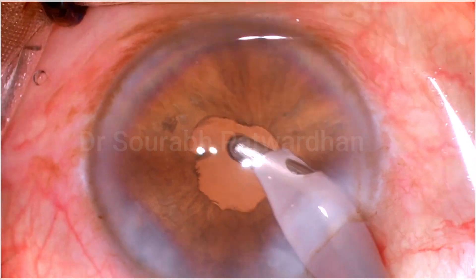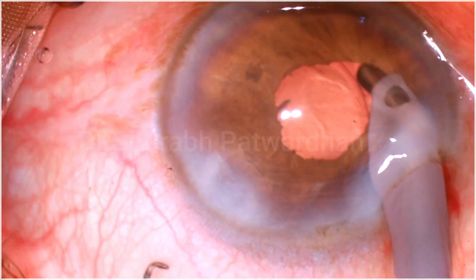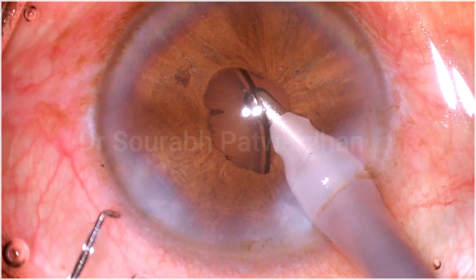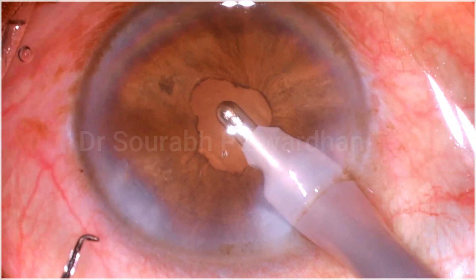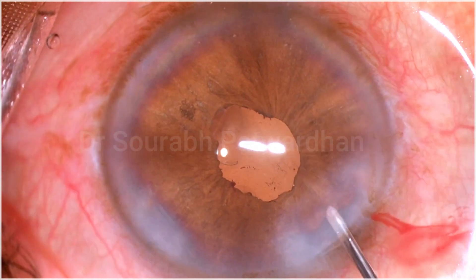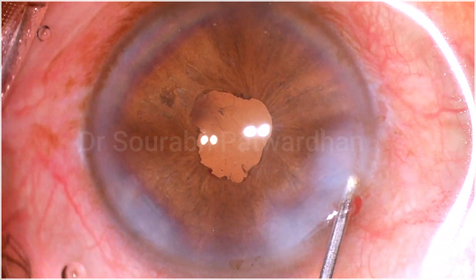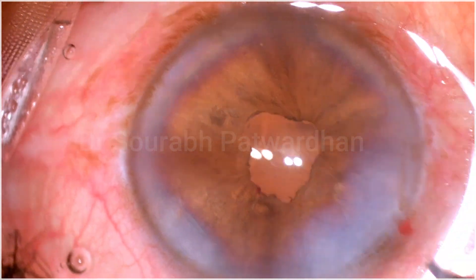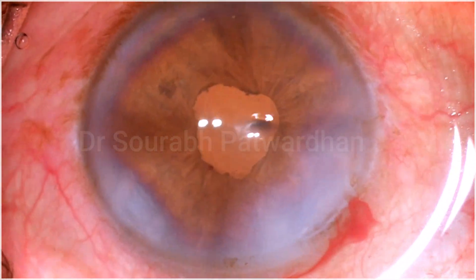A good thing is that it's very gentle on the pupil, so usually you don't get a dilated fixed pupil after using this device. Visco wash and OVD wash is very very important in this case — particularly you have to wash out all the OVD from the bag so you don't get post-operative inflammation or capsular distension. You have to give enough time for a complete OVD wash. And now the case is complete. Intracameral moxifloxacin is given, and you can see the iris is trying to come out of the main incision because an ACD of 1.88 mm is an extremely shallow anterior chamber with very little margin for error and very little space to work in. You also have to be very careful about the endothelium.